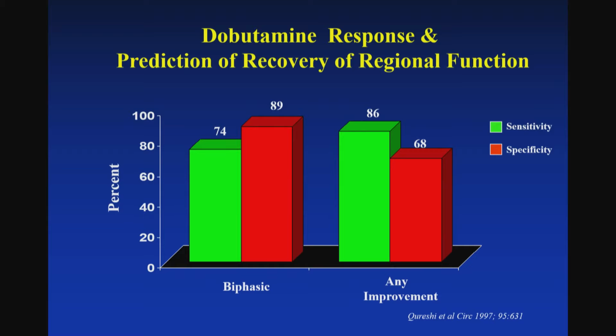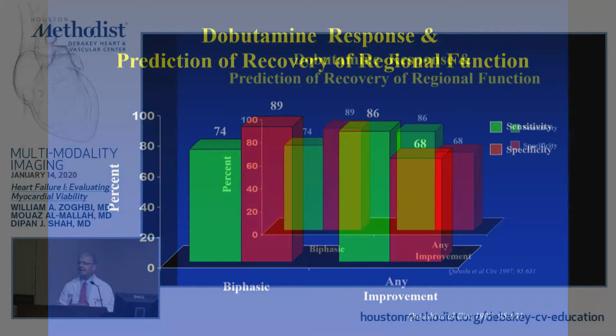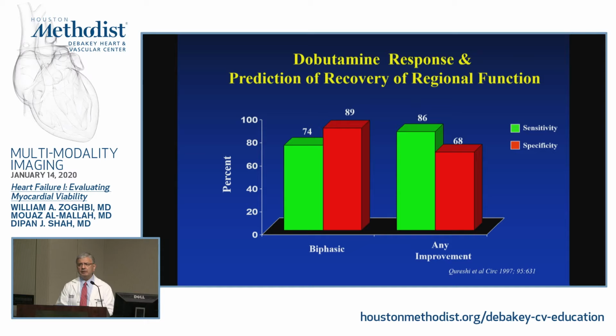So if you ask me what is the most... If I want to push the sensitivity of echocardiography to the most, I'll look for any improvement. Right? Biphasic is very specific, so it depends how you read it. If I'm seeing ischemia, I can take it to the bank. Most of the time, more than 80% of the time, you're going to have some recovery of function. I'm not going to share with you that the recovery of function is much more magnified if you stress them again. They had no reserve before, and now they don't only get ischemic, the ventricular function improves so much, right?